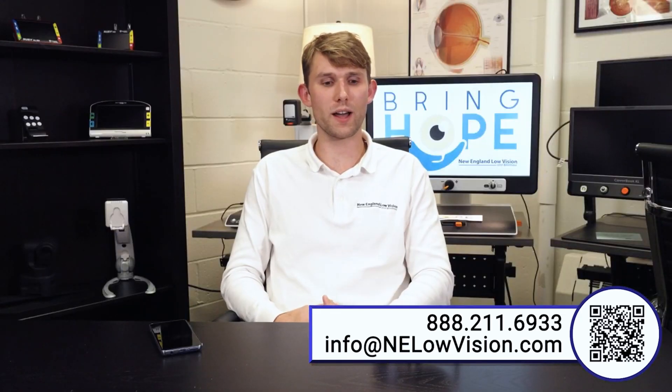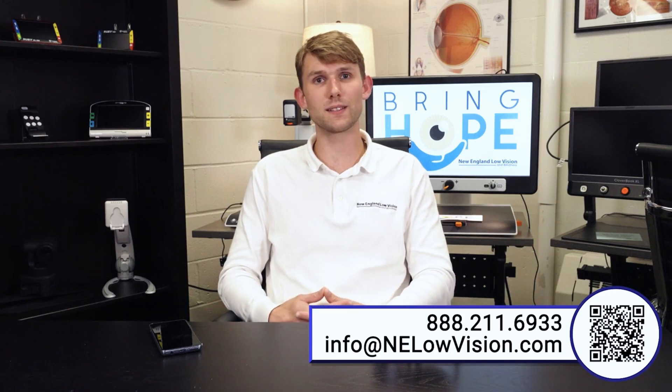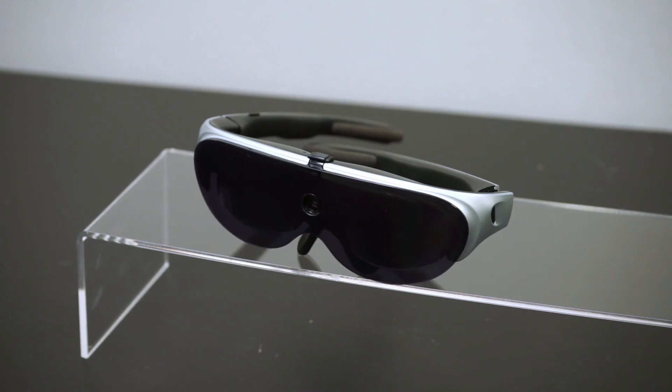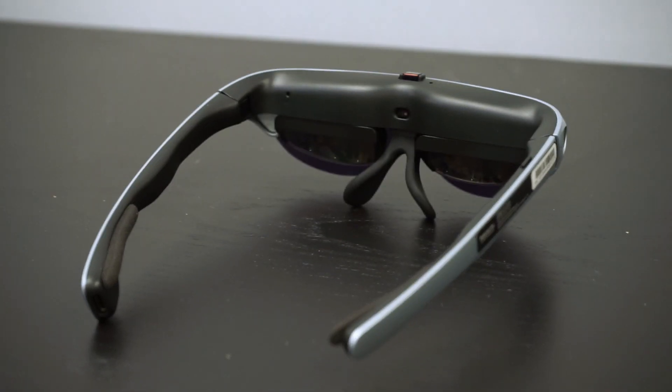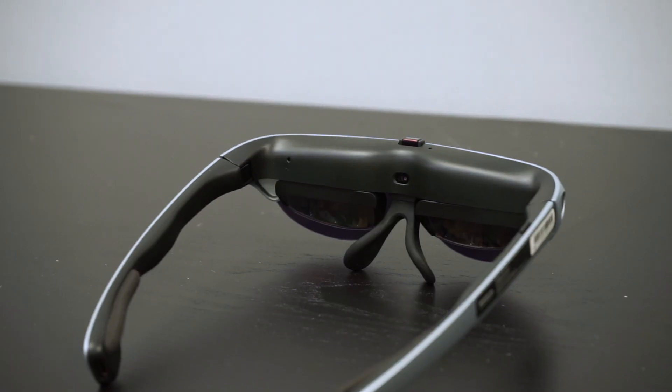In this video, we're going to outline all of the features of the Idaptic i5 as well as adding in the Idaptic i6 AI features. The Idaptic i6 is an open system wearable, which means that it utilizes a sunglass-like wearable that light and air is able to pass through.